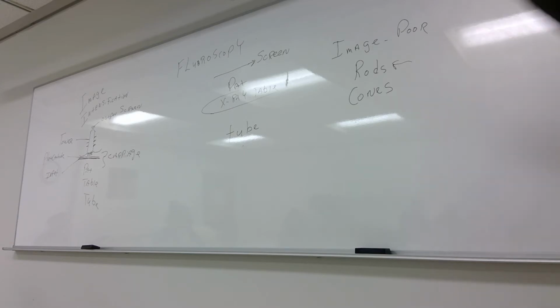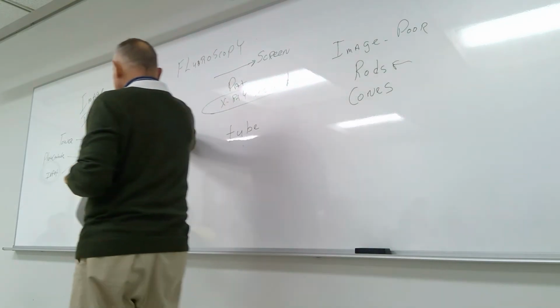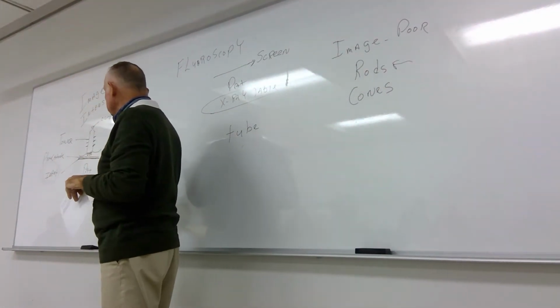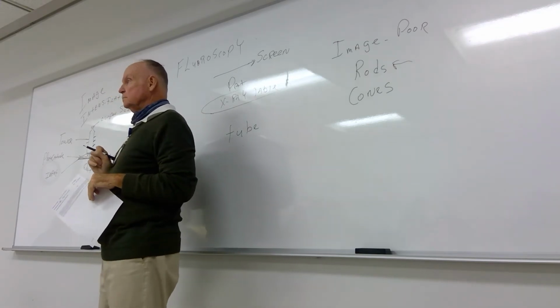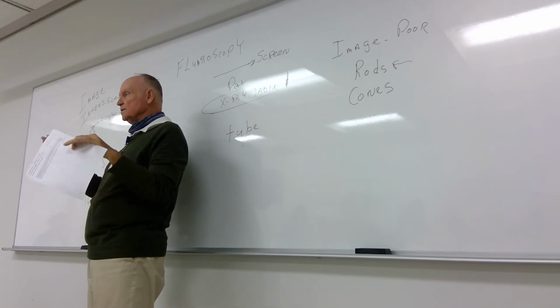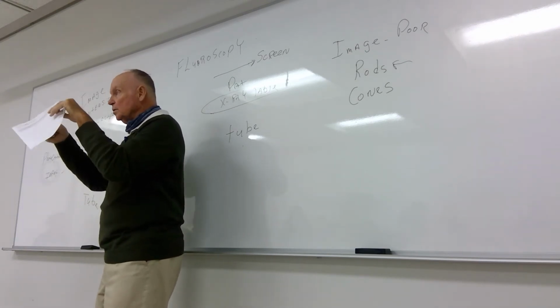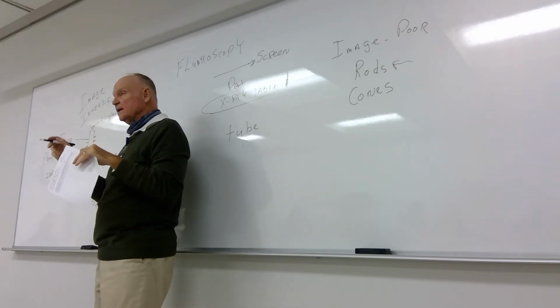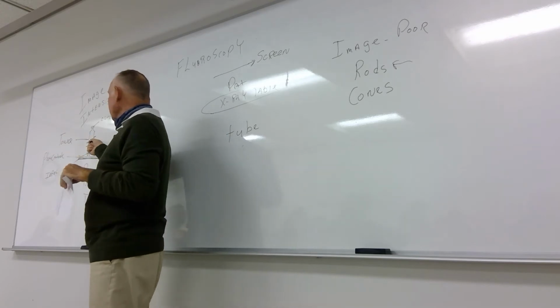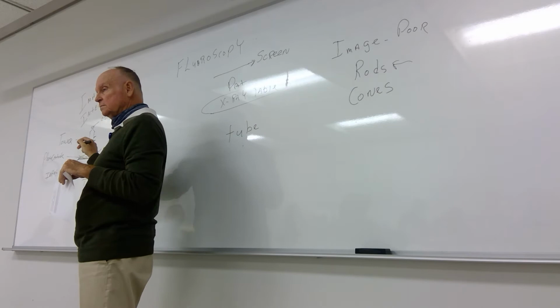So they're racing up that tower and banging into the output screen. They're called electrostatic focusing lenses. They pull with different charges, and this is continuous.